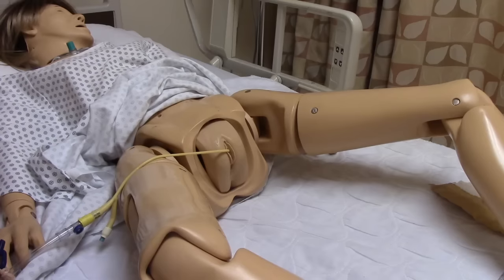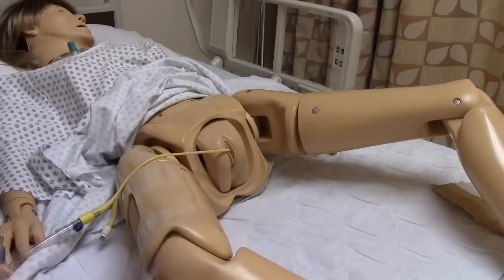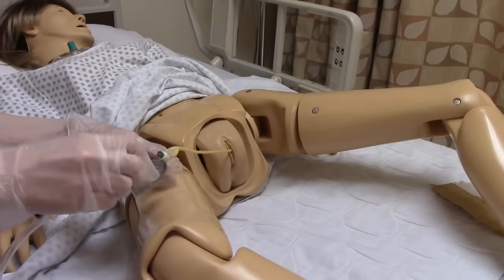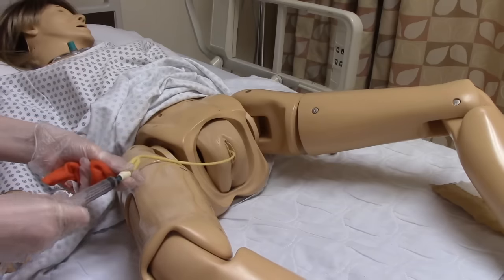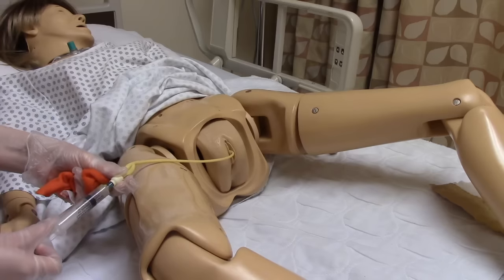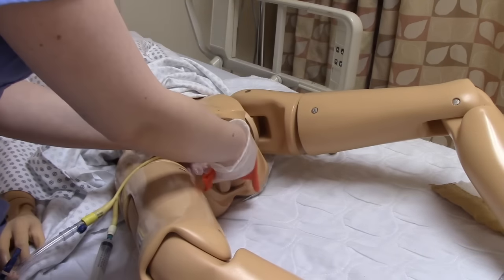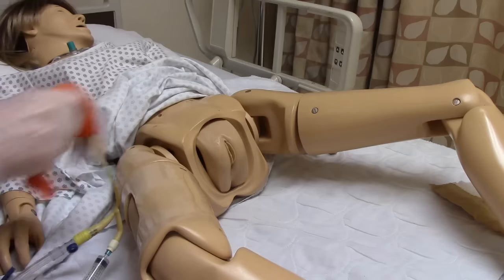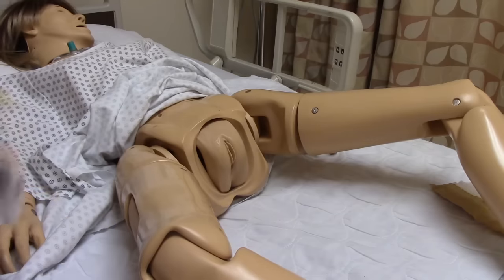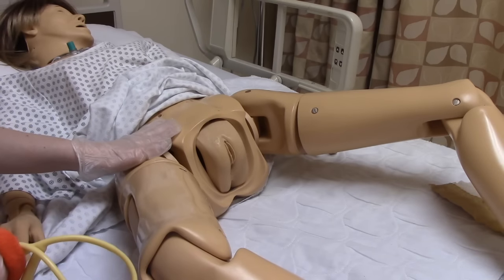Discontinuing a catheter is really quick and easy. It is not sterile and you only need a couple of supplies — gloves, an empty syringe, and a washcloth. Put your syringe in the port and pull back to deflate the balloon. Then take your washcloth, tell your patient to take a deep breath — one, two, three, pull — it's out and done. Dispose of the used catheter properly and perform pericare or assist the patient to perform pericare.